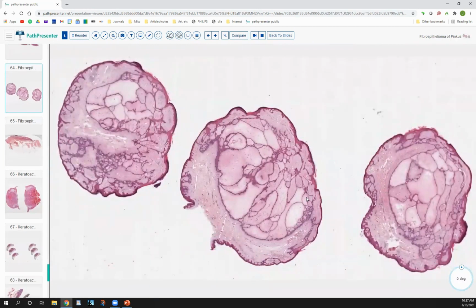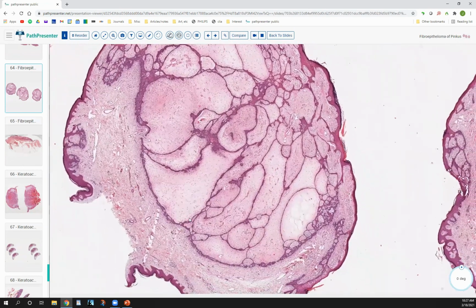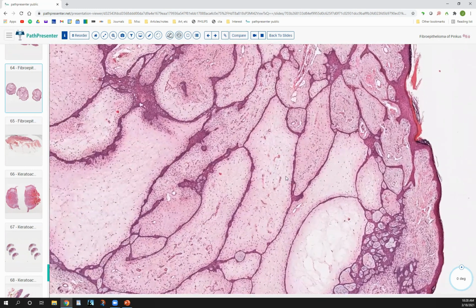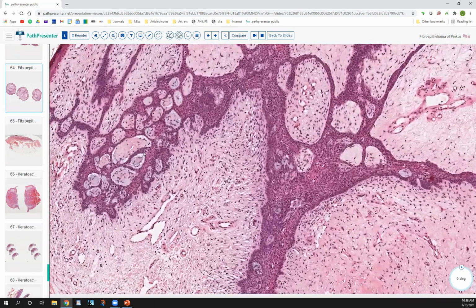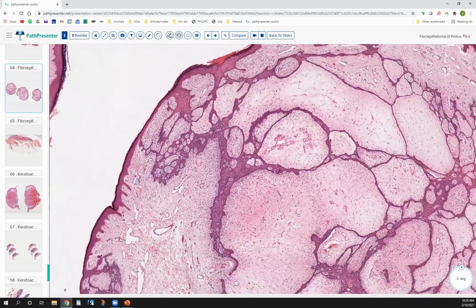Okay, so then we go on to my favorite one because it's so recognizable. This one has these interanastomosing strands of basaloid cells, which at this power, I think most people looking at this are either struck by it or know what it is. And the intervening stroma tends to be very loose, edematous, or more fibrotic, not quite as mucinous as what you see in classic basal cell carcinoma. But you do have areas where it does resemble just classic basal cell, even a little bit of this peripheral clefting maybe. This looks very basaloid to me. So this is a low power diagnosis.